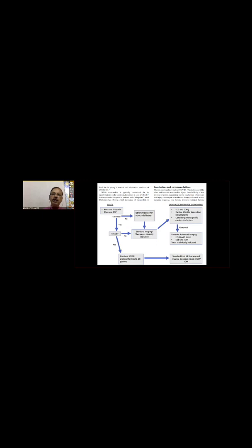But if you go to the individual segments of strain, you can find the areas where culprit vessels may be affecting a particular part of the myocardium, so the strain value of a particular segment is most important.